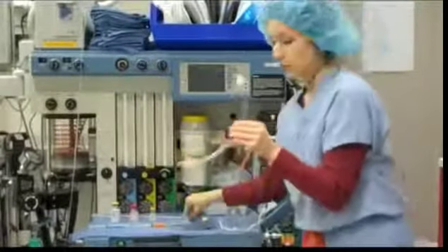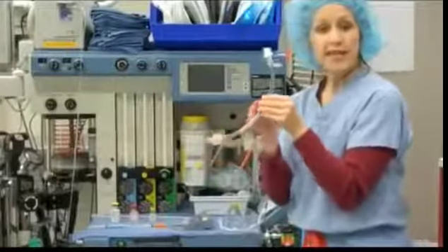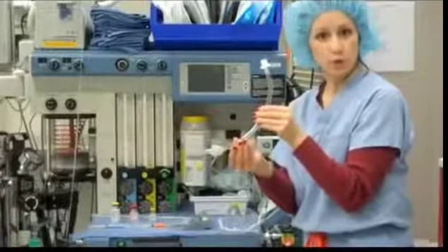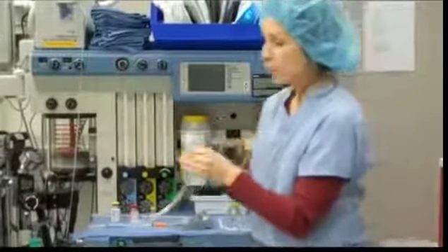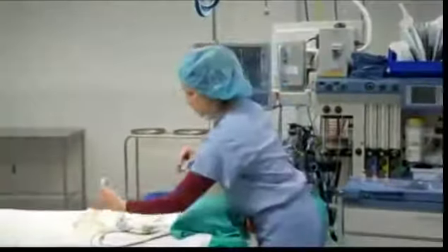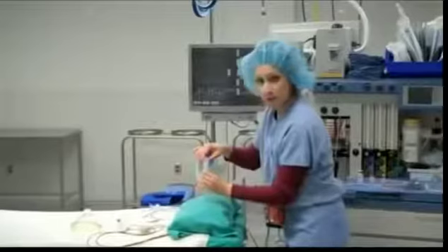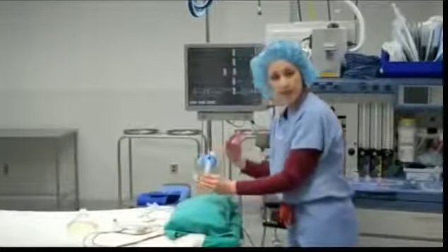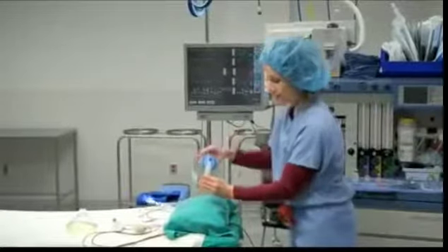So now, this cuff is inflated and it is sitting inside the patient's trachea, so the breathing tube won't move. Okay. So what I'm going to do is attach this breathing tube onto the circuit here to demonstrate, once this breathing tube is in, how we then go ahead and manage the patient's general anesthetic, okay?